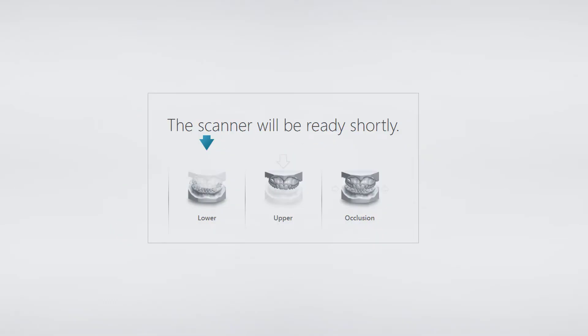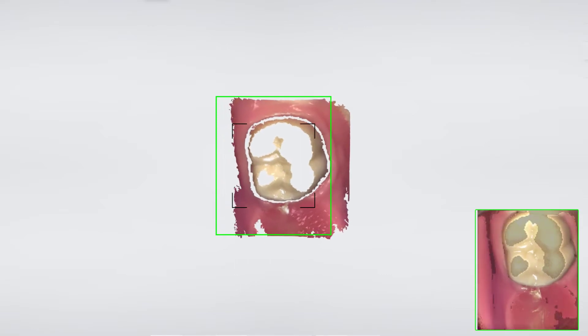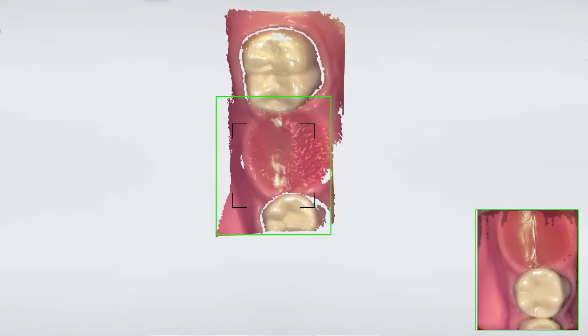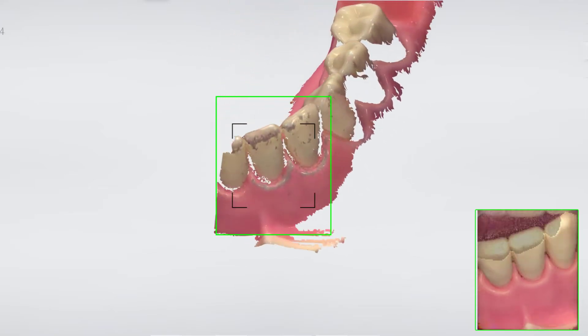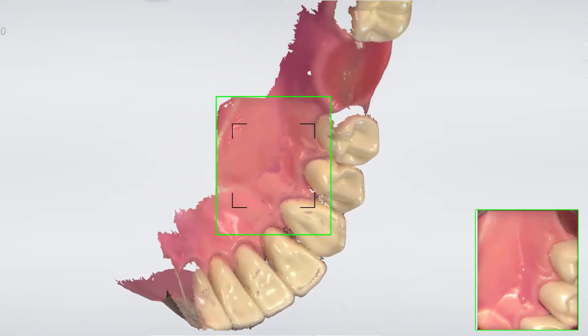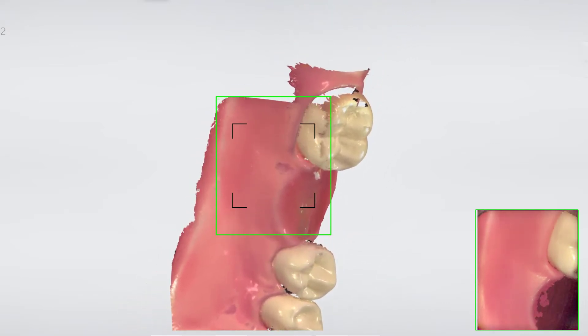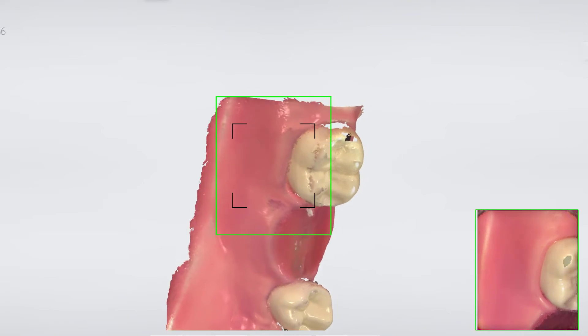When scanning for a tooth-supported surgical guide it's important to scan the teeth but also the soft tissue in the region of interest — not only the top surface of the crest but all the way down on the sides. Start your scan from the occlusal on the most posterior tooth following the official scan strategy. When turning lingual, try to go as deep as possible, using the tip to push the tongue aside if possible, with a 70 to 80 degree angle so that the scanner can grab images of the whole crest.